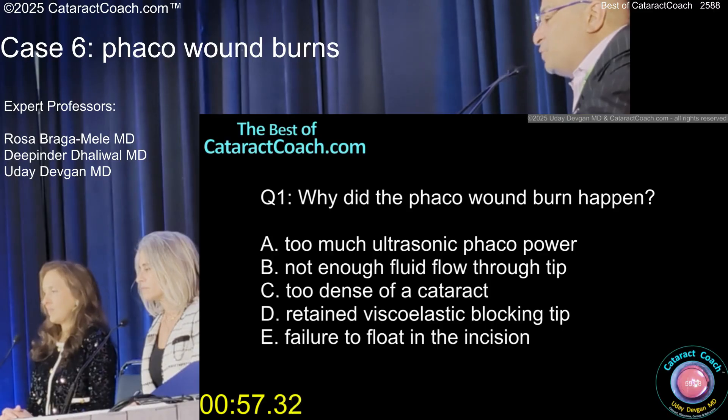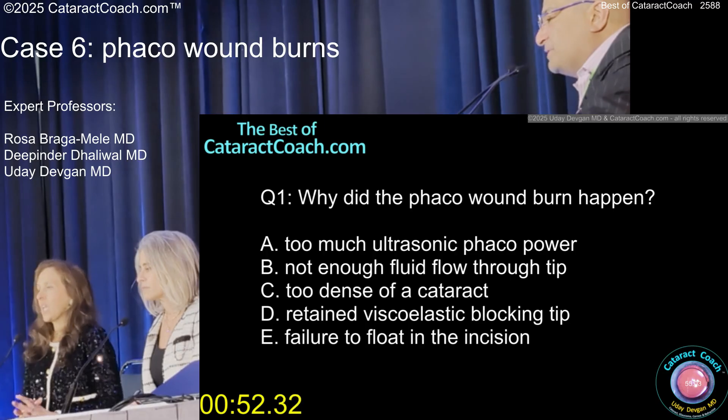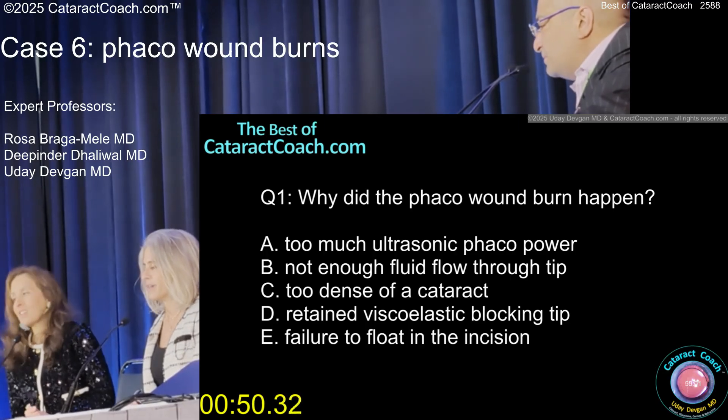So why did it happen? Was it too much power, not enough fluid flow through the tip, density of the cataract, retained viscoelastic, failure to float in the incision — or all of the above? All of the above.